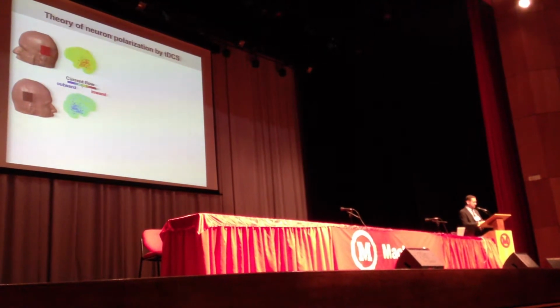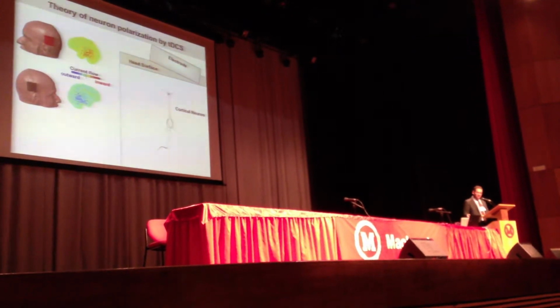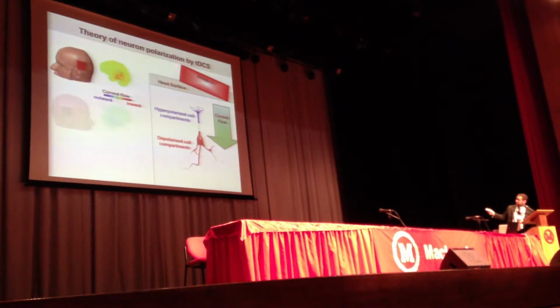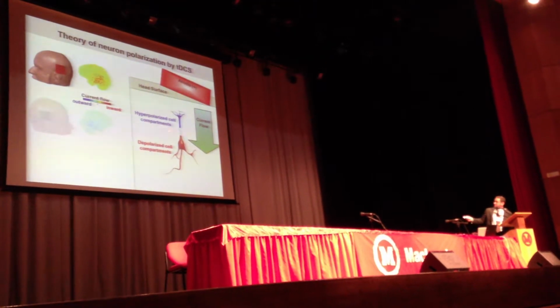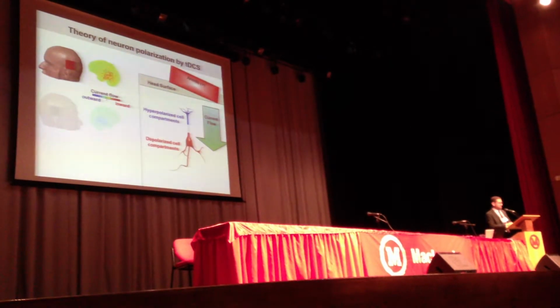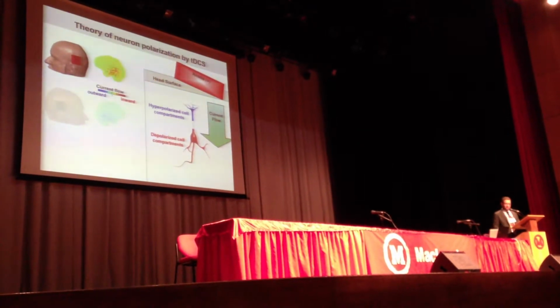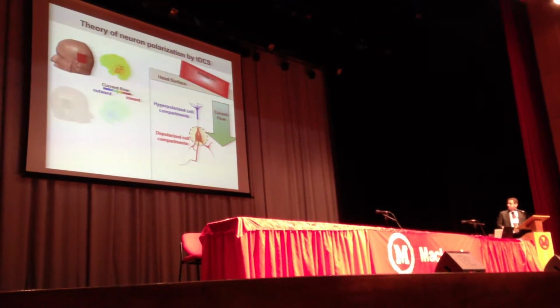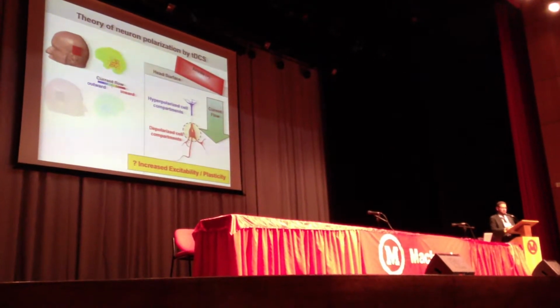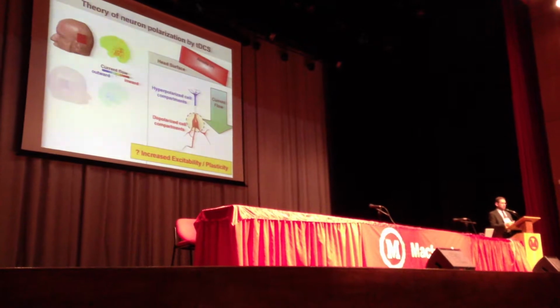So if we go back to this notion of anode and cathode and look specifically at what's going on at the cortex, when we have an anode, the assumption is that current is going to flow down, as I mentioned, into the brain. So this is the downward direction. And this is believed to produce a somatic depolarization and to hyperpolarize the other end of the cell. This is something that has been around now for several decades as far as how people believed direct current polarizes cells. And so anodal stimulation would therefore be presumed to increase brain function because the soma is the thing that's important. And by depolarizing the soma, we are somehow, and this is a big somehow, making people better at math and so on.